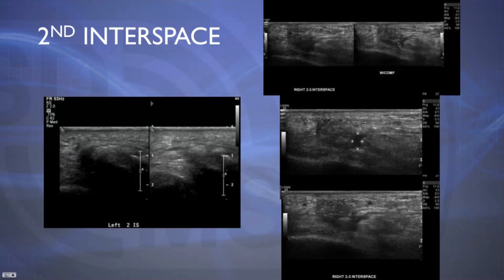neuroma. This is an example here where we did do compression, and this did not compress out, and this turned out to be a neuroma. And this one is even more confirming, and it's the same patient, by showing the actual nerve going into the soft tissue mass.